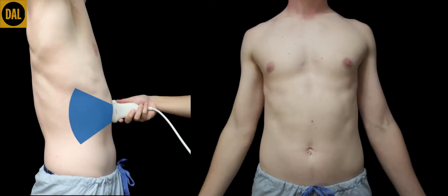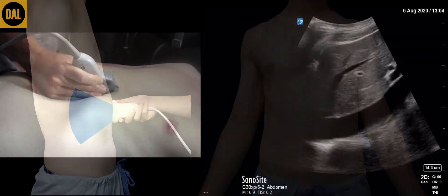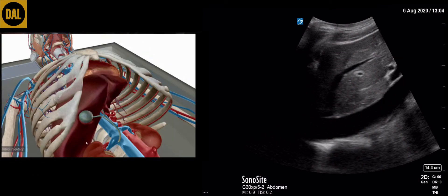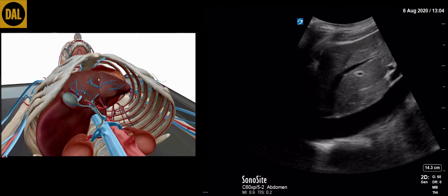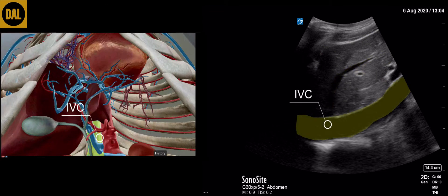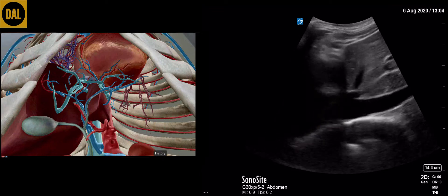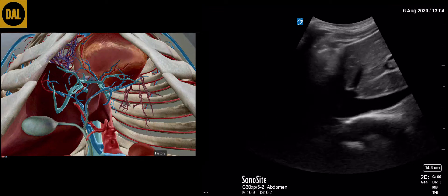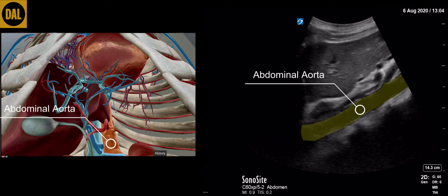This scan is obtained by placing the transducer in the longitudinal plane in the midline in the sub-xiphoid space. During this scan we expect to see the following structures: the liver, including both the portal and hepatic veins, the inferior vena cava, the right atrium, and the abdominal aorta.